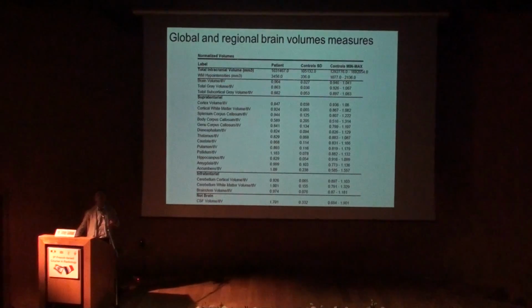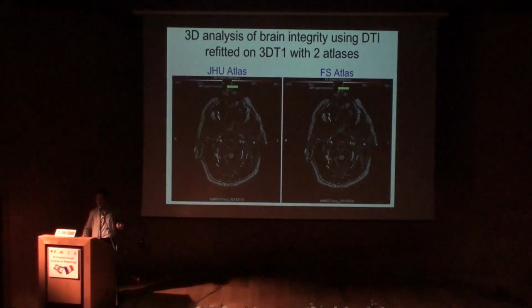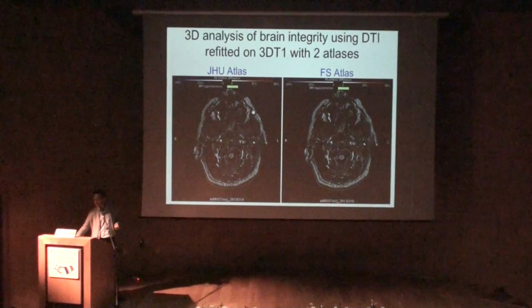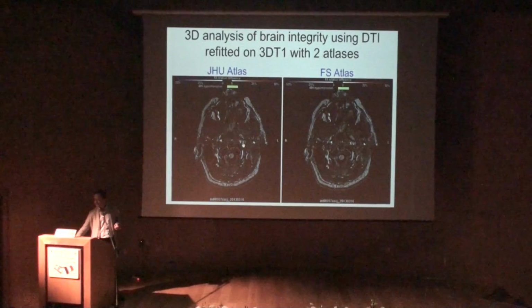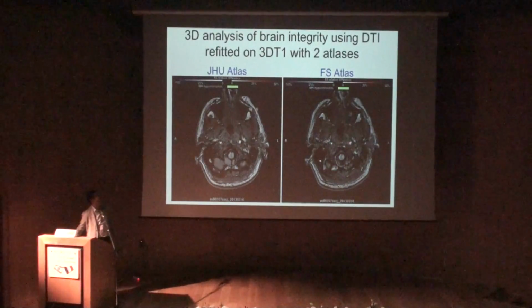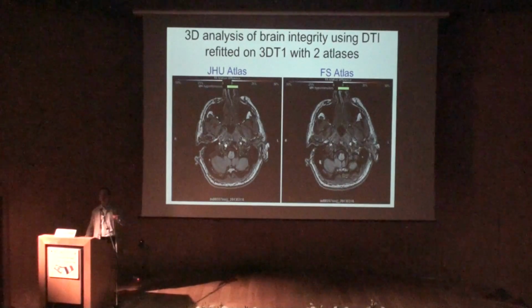You also get FreeSurfer analysis, so you get the volume of all brain regions as compared to controls and the variation. So you can, in fact, use this information for your studies. That's available. And then you get these FA maps using DTI.